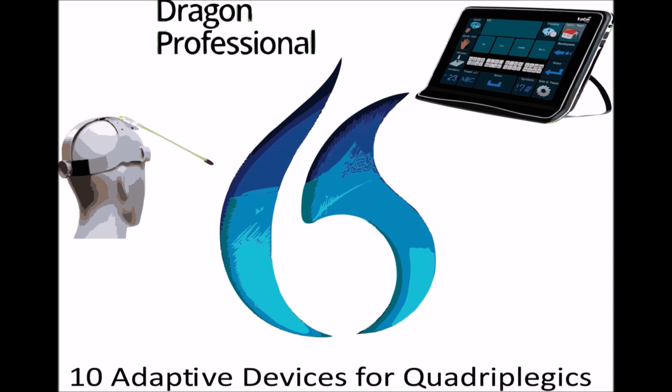There are different types of hand splints, including resting hand splints, which immobilize the hand and wrist in a neutral position to prevent deformities and relieve pain. Functional hand splints are designed to support hand movements and assist with specific tasks, such as grasping or holding objects. Dynamic hand splints are used to help improve range of motion and muscle strength.